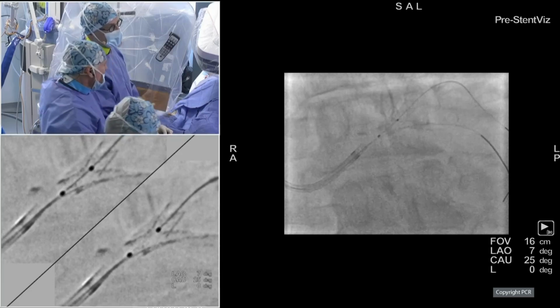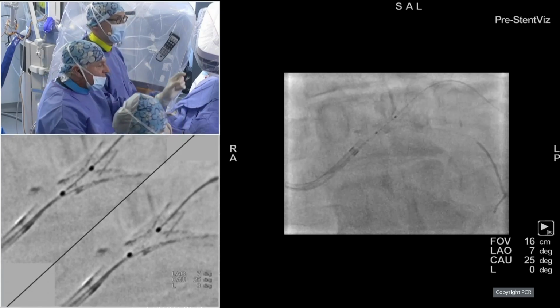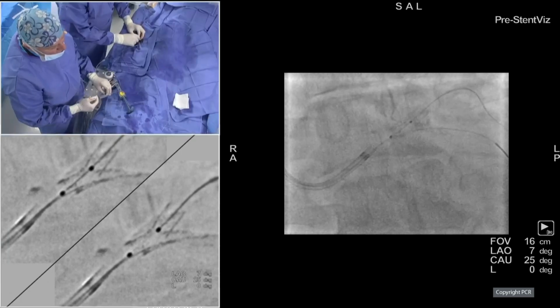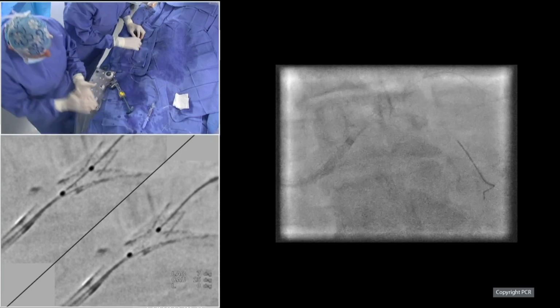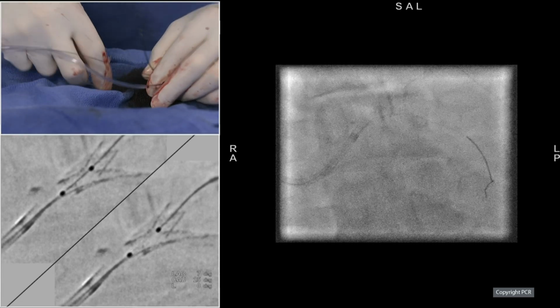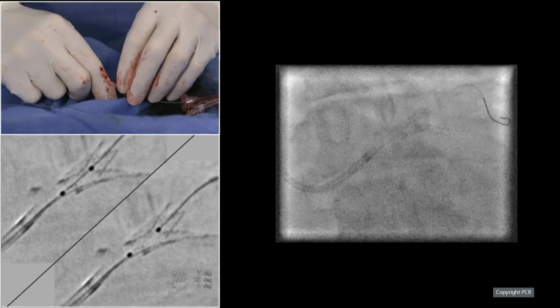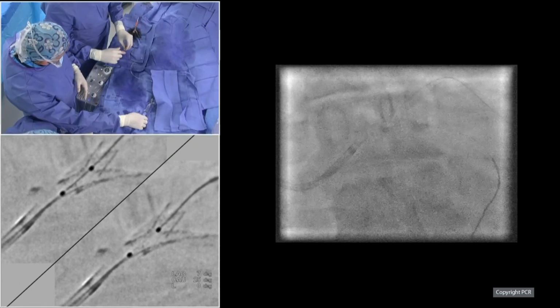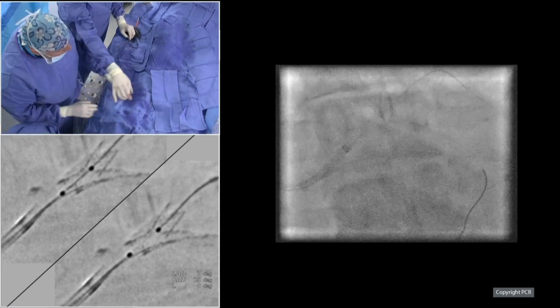Yeah. So you see, we do all our best to avoid this, but this situation happens. So maybe we will need a short stent in front, 4.0 by 8, in order to correct this, because here the stent is not fully covered. 4 par 8. You see, and that's an important message. Each time you try to force during a left main stenting, you can have this problem. Longitudinal stent compression. And that's, I think, a main message.